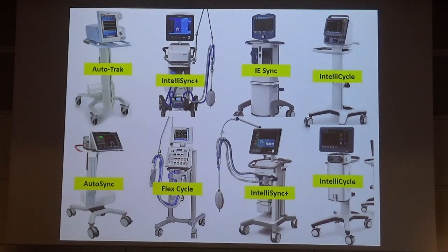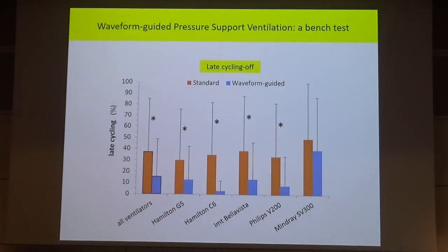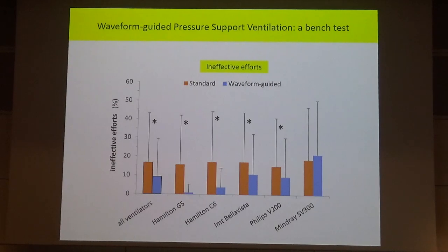We performed a bench test, enrolling all the mechanical ventilators equipped with a waveform-guided triggering or cycling-off system. And we observed a clear advantage of this automation, especially in decreasing the amount of late cycling and the number of ineffective efforts. A clinical trial on waveform-guided pressure support ventilation is ongoing.